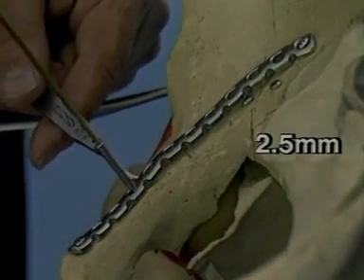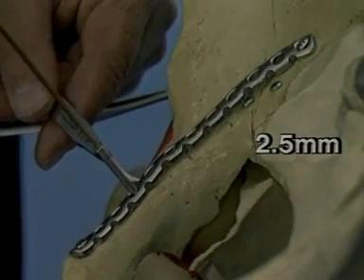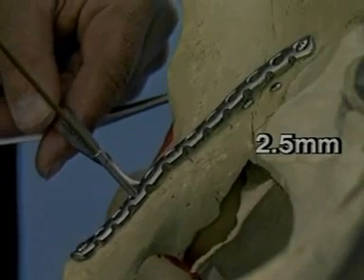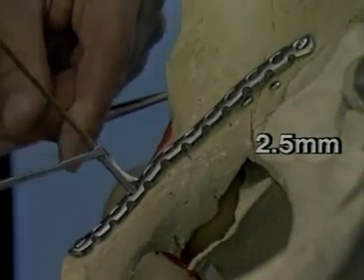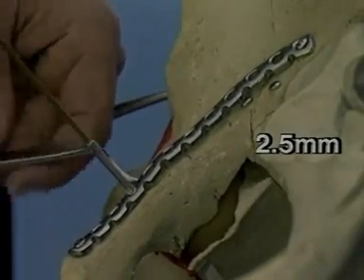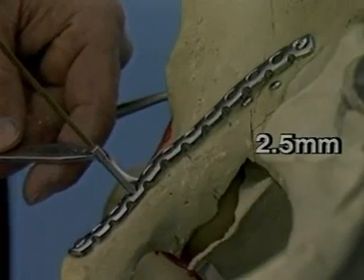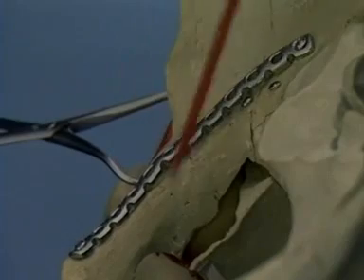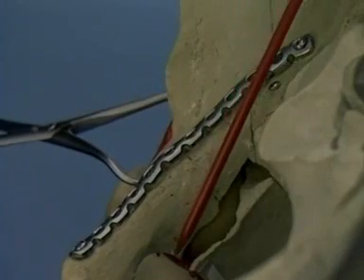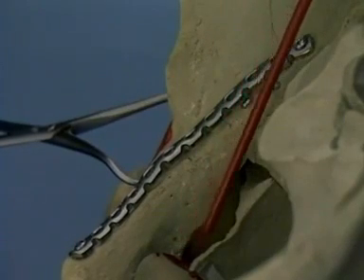When holes are drilled through the lateral portion of the superior pubic ramus and the obturator canal is entered, too deep penetration can injure the obturator nerve. The red pointer shows the position of the obturator nerve.